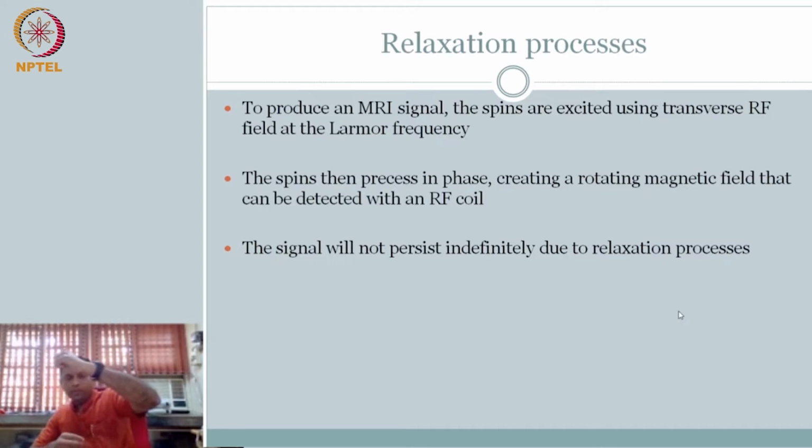Now the excitation pulse is off. What is going to happen? Ideally speaking, you have created the coherence, and it will keep doing this. But nature is not like that. There has to be some loss. Nothing is perpetual in life, right? So what happens is, the moment you take the excitation, they all try to obey the command only till the excitation is there. But thereon, nature kicks in.